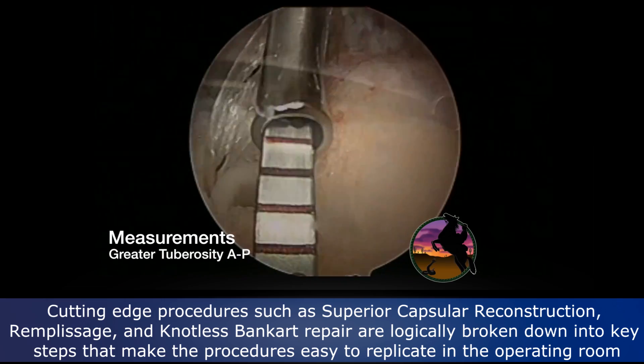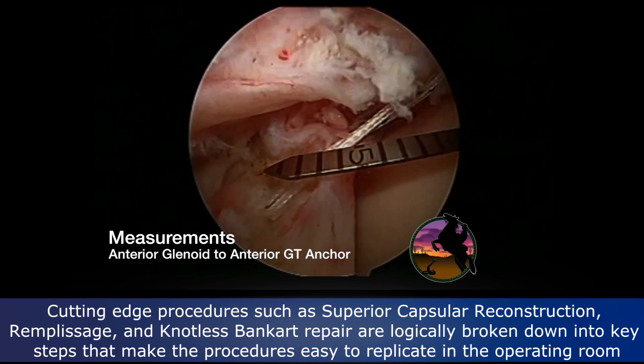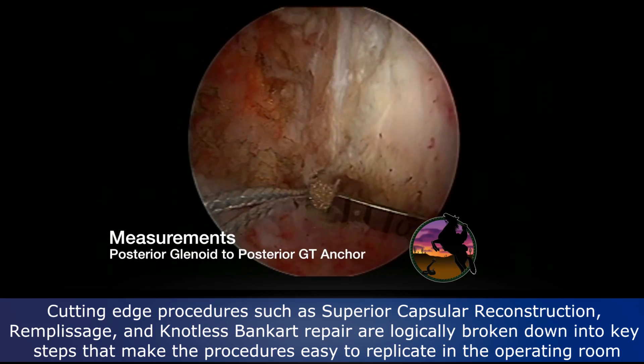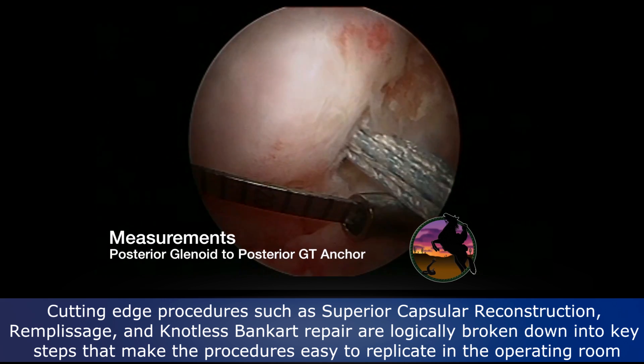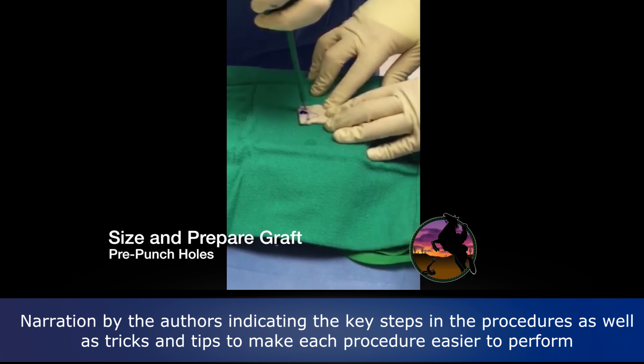These humeral anchors on the medial aspect of the articular margin are swivel locks that have fiber tape preloaded. We measure from the tuberosity anchors to the glenoid anchors as well so that we can pass them through the graft outside of the body.